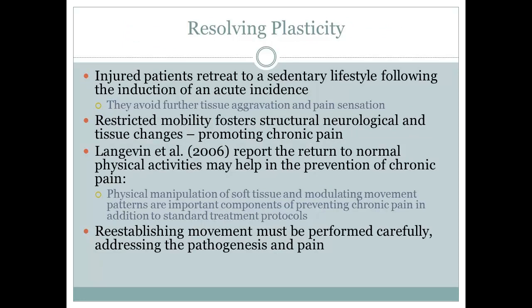Now that we see that the EML reduces one's pain by activating the photoreceptor and changing the biochemistry, we also see now, by reducing the pain and helping to promote some degree of tissue regeneration, that there's an improvement in linear range of motion. Why are these two things important? Improving linear range of motion and reducing pain.